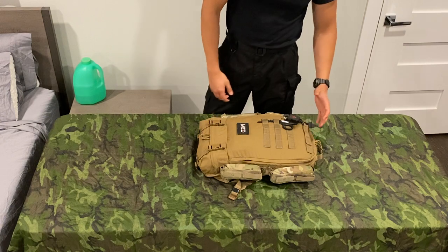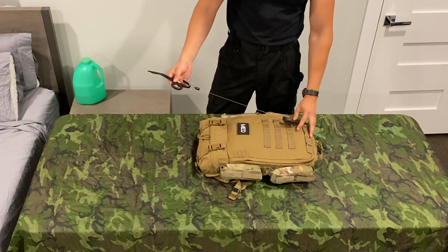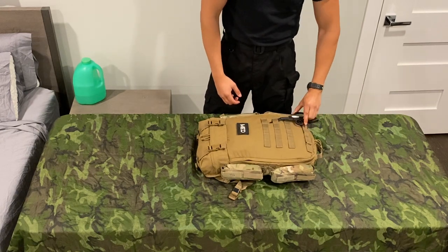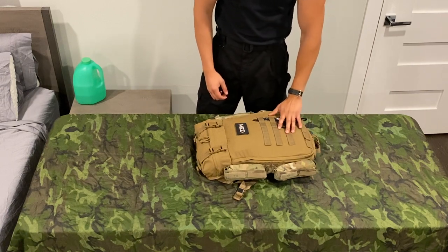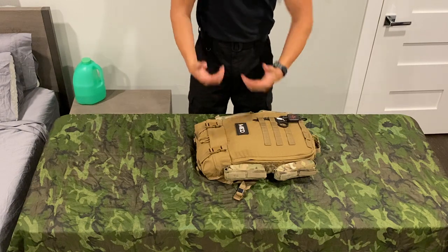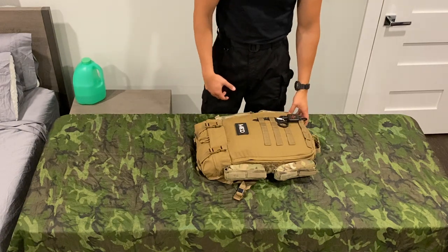On the outside of the pack itself, I do have a set of trauma shears on a North American Rescue shear leash, just so you don't lose them. I find that's a pretty good place to keep them. I usually have my Raptors on me as well when we're in the field, but this is just a nice little backup. It's not always you as the medic that's going to be using the bag, so that's something you have to take into consideration.